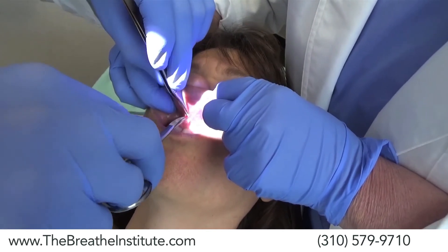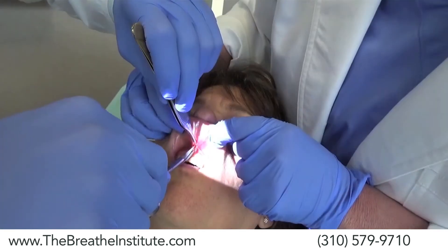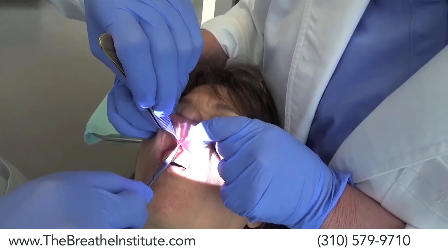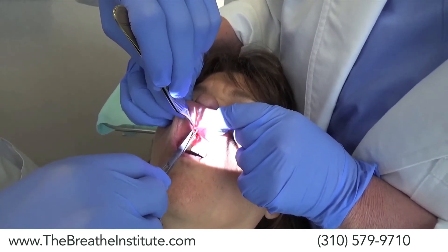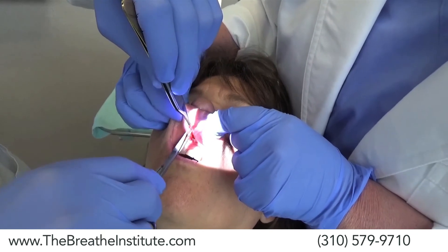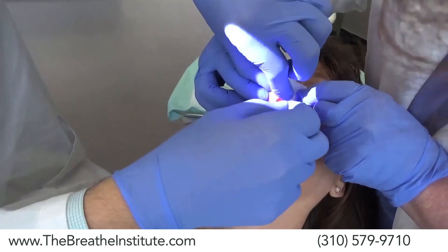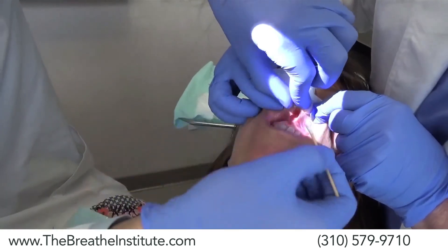Dr. Zaghi is going to remove the frenum. By removing the frenum material completely, there's less of a chance that it will grow back. Shortly after this procedure, this patient had Botox injections under the nose, which caused the tissue to relax, and she's reported that her severe allergy symptoms have not returned since the procedure was done. There is a lot of scar tissue from the laser — it's better now. He's releasing the remaining tissue with a q-tip.